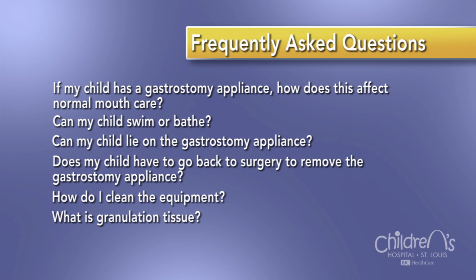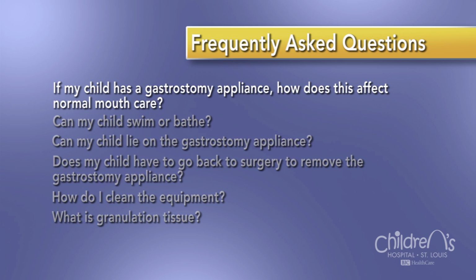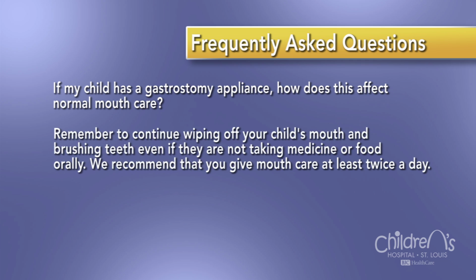Here are some frequently asked questions. Please refer to this list. If you have a question that is not answered, please contact your doctor or the surgery office. If my child has a gastrostomy, how does this affect normal mouth care? It is important to remember to continue wiping off your child's mouth and brushing your child's teeth, even if your child may not take medicines or food by mouth. We recommend that you give mouth care at least twice a day.